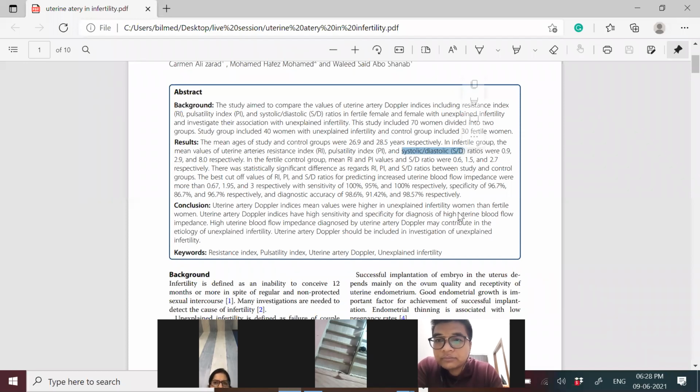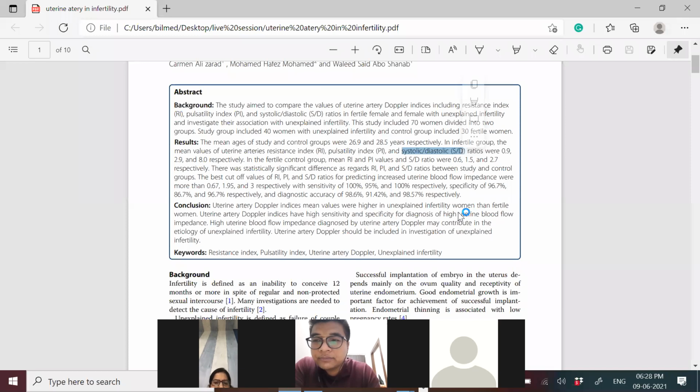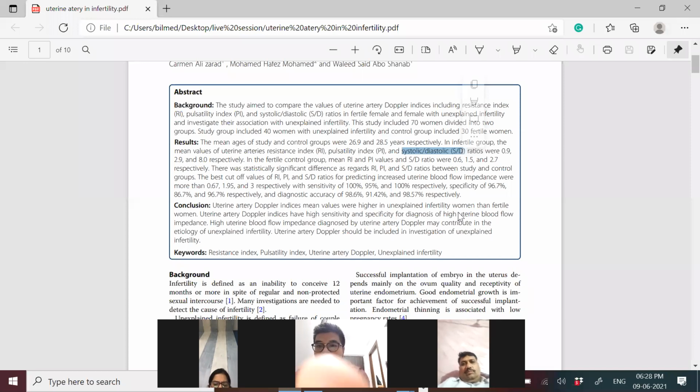This is nothing but the calculation of systole upon the diastole. So if there is infertility, see for the uterine artery, maybe that you are dealing with a high PI of the uterine artery, which can be the cause of infertility in that given patient. So this was a brief explanation of the answer.